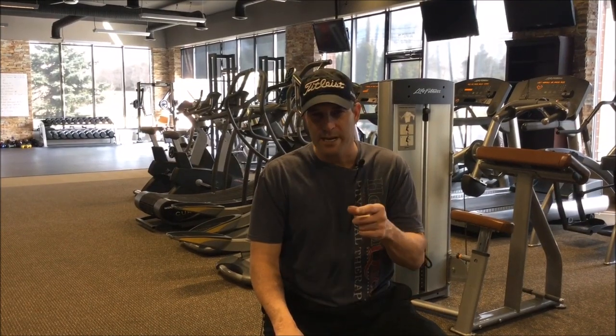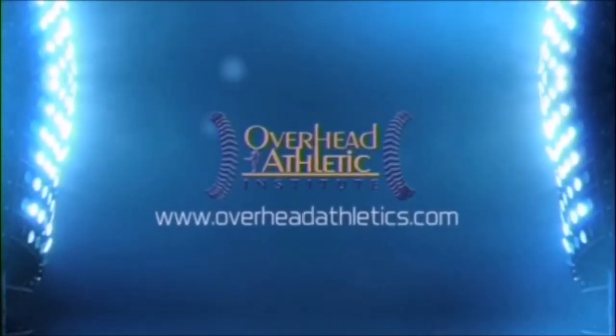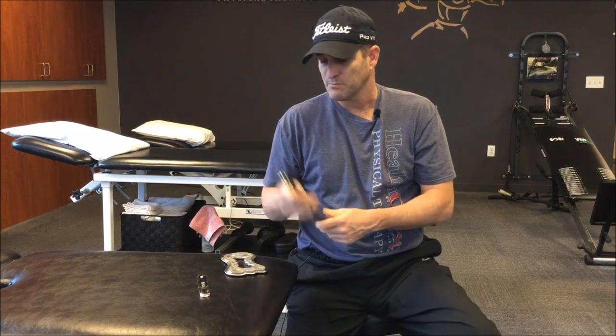In this video, I'm going to show you three Graston techniques that I use with all of my Tommy John athletes. I use Graston a lot in my clinical practice — I've bought multiple sets for my clinics. With what we're going to show today, we're going to use two tools: one that's more diffuse and one that's more pointed.